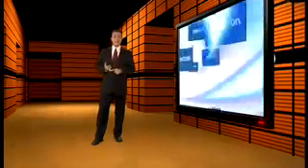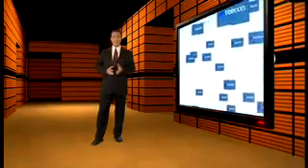iRoute can connect data and images from virtually any system or company, such as Topcon, Haag-Streit, Zeiss, and OIS, as well as from multiple technologies, including visual fields, OCT, and ultrasound.